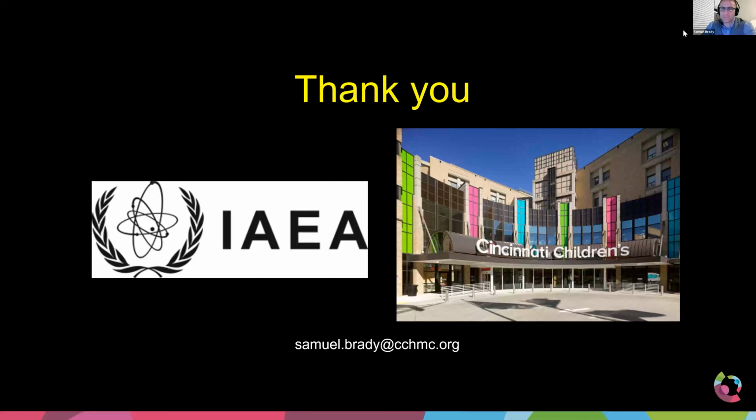So that means in the future, when we have a good image reconstruction like deep learning, we can even lower the radiation dose to the patient because we can do a post-processing technique. Yep, I'm definitely going to talk about that in my next talk. But the answer is yes, we can do that. So yes, if we want to continue to reduce, quote unquote, the risk by reducing radiation, definitely yes. I would argue, and that's why I'll show you some pictures, that we're already pretty low dose most of the time.